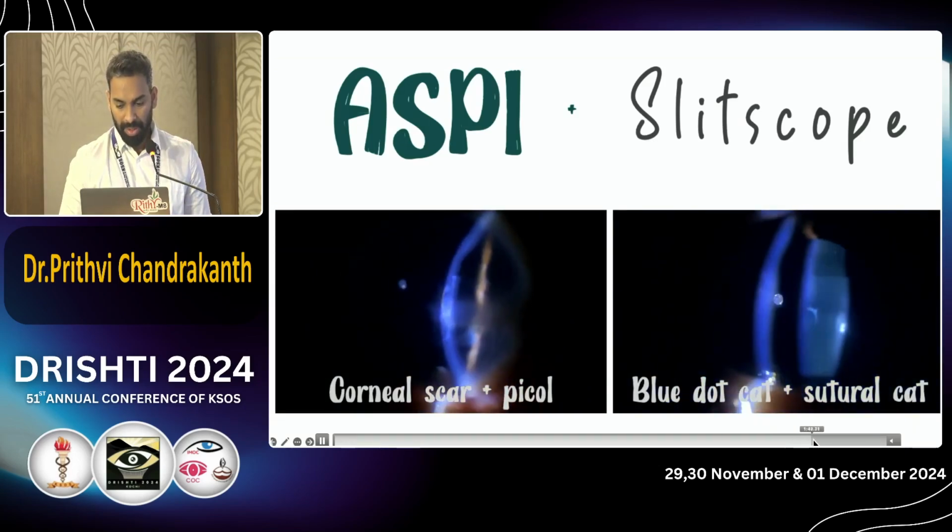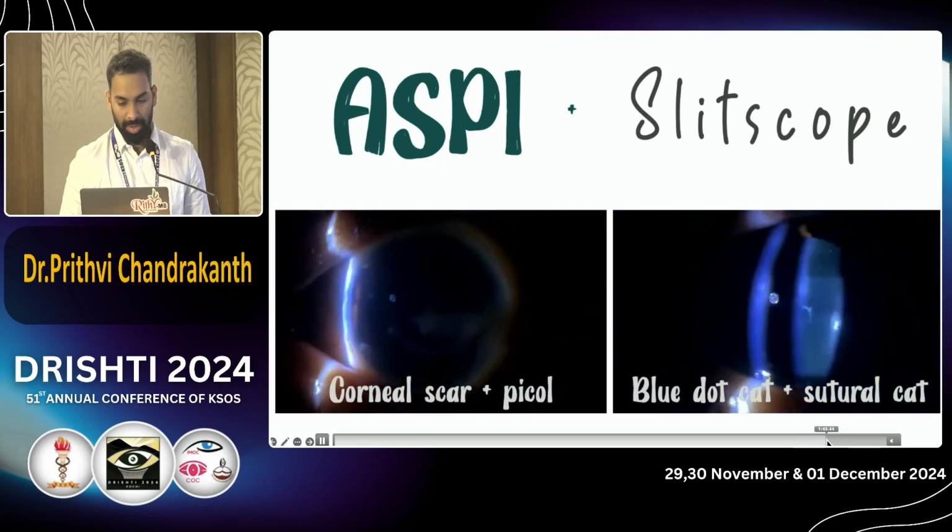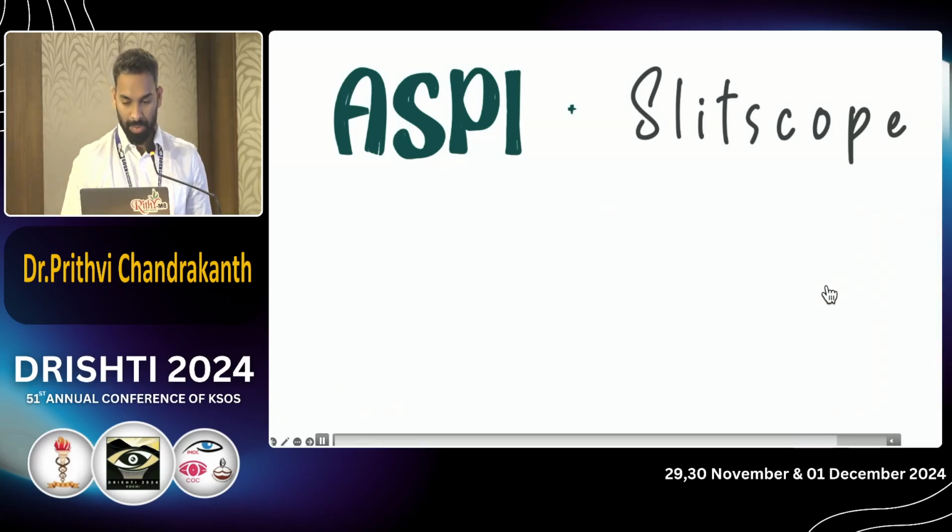And these are the different cataract grading we could take, and you can see how clearly the slit was working well for us.